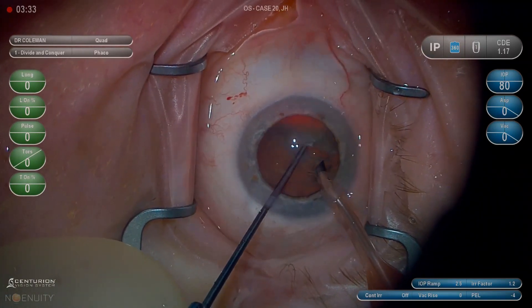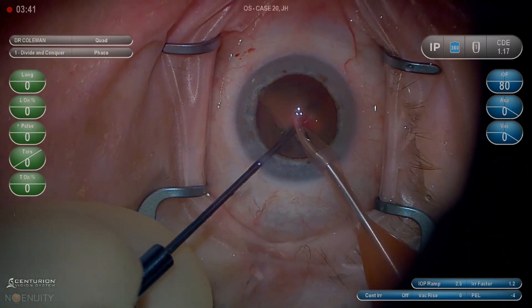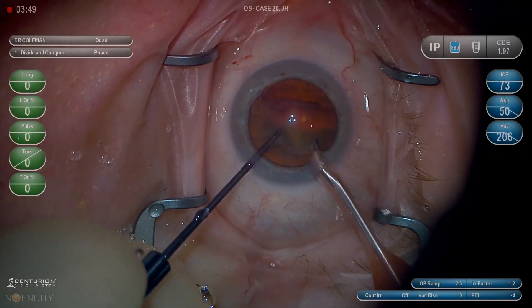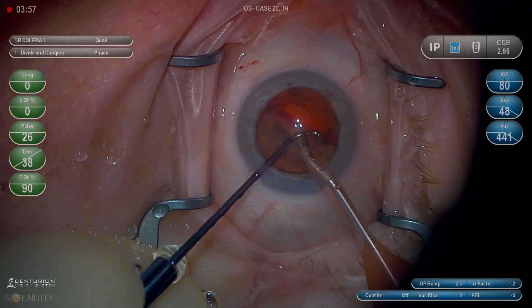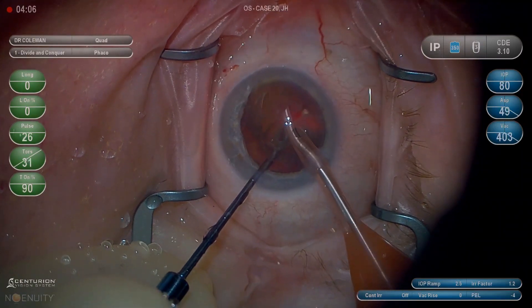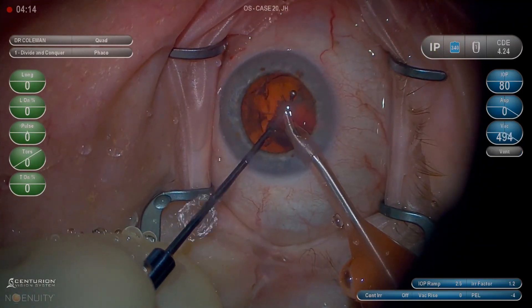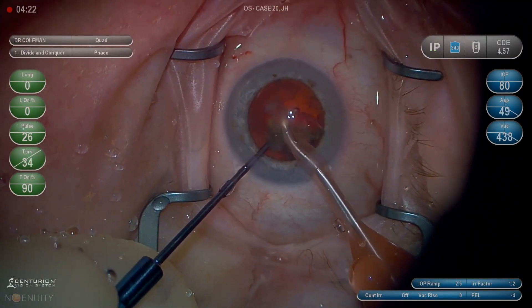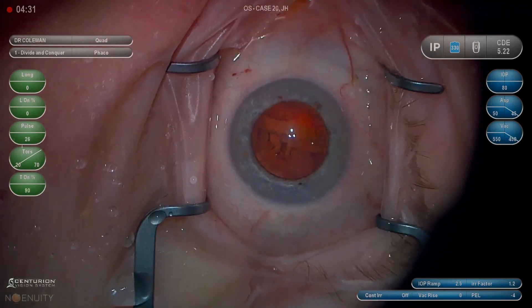Here we go with the distal crack, then the proximal crack. I'm basically wiggling the Connor out into the equatorial nucleus. They're optically almost on top of each other — this is near a perfect quarter, exactly what I want. I'm going to rotate and scoop the next quarter up, engage it. I'm going to let go with the phaco before I crack in most cases, and scooch the phaco down. That way I crack a clean quarter off. I don't want to crack off a sixth or an eighth and have a really big chunk still in the bag — that forces me to crack again and slows me down.